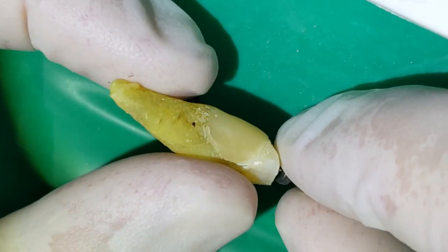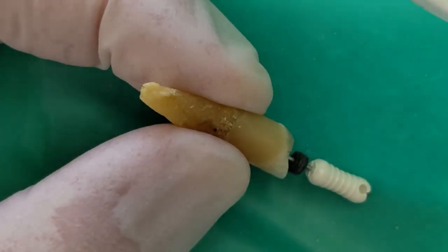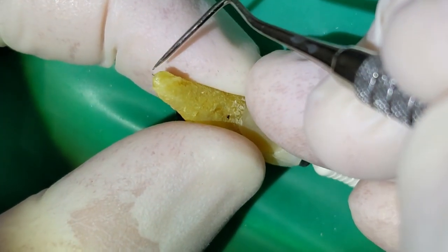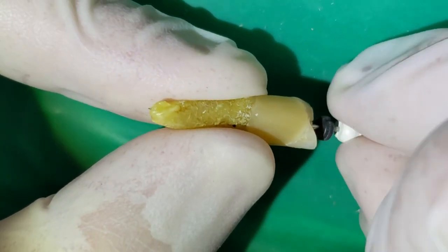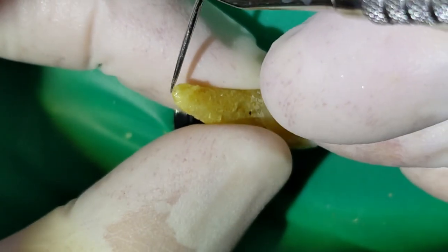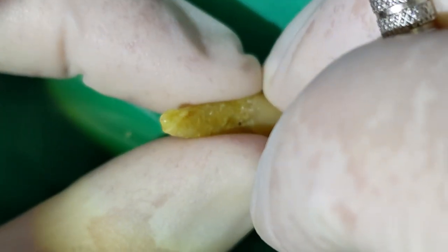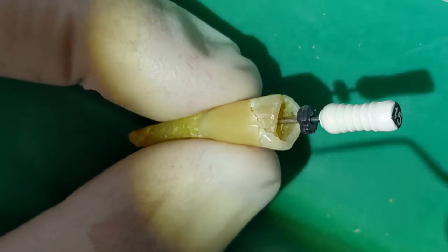Yep, there it is. See it against my glove there? There's the root. There's the file coming out the root tip. So now we know how long. Let me just pull that back a little bit so we're flush. So that is how long the nerve canal of that tooth is.